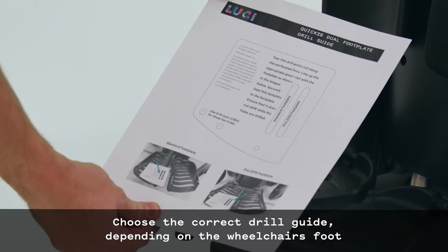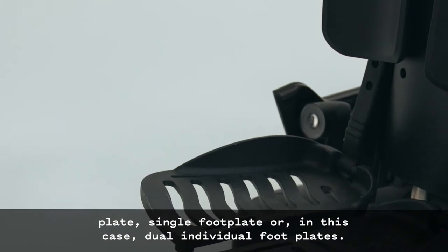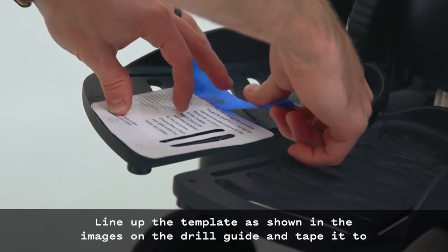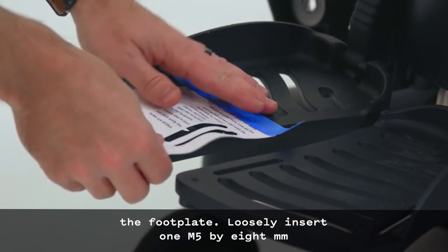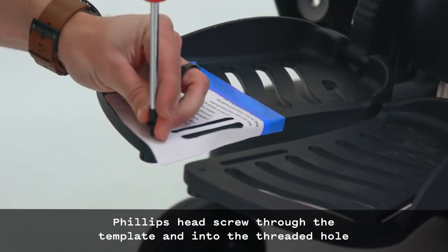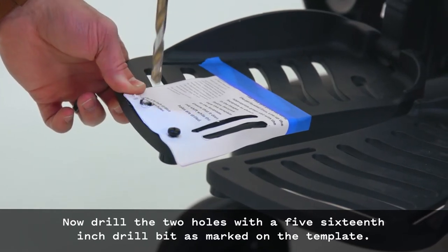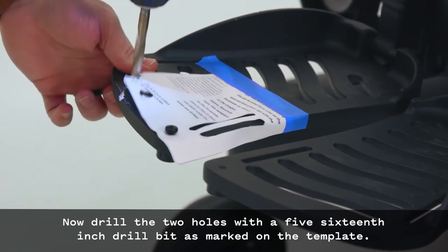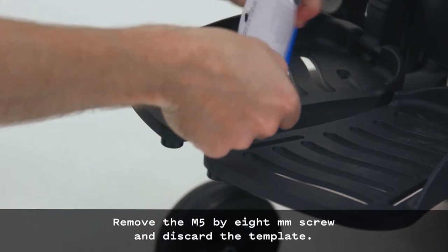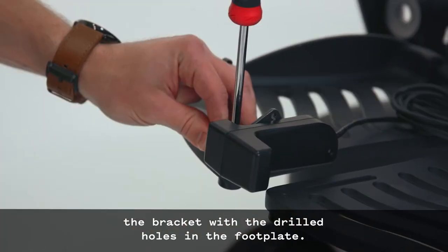Choose the correct drill guide depending on the wheelchair's footplate — single footplate or dual individual footplates. Tear out the drilling guide along the perforated lines. Line up the template as shown in the images on the drill guide and tape it to the footplate. Loosely insert one M5x8mm Phillips head screw through the template into the threaded hole to keep the template in place. Drill the two holes with a 5/16 inch drill bit as marked on the template. Remove the M5x8mm screw and discard the template. Place the scout on top of the footplate, aligning the screw holes in the bracket with the drilled holes in the footplate.